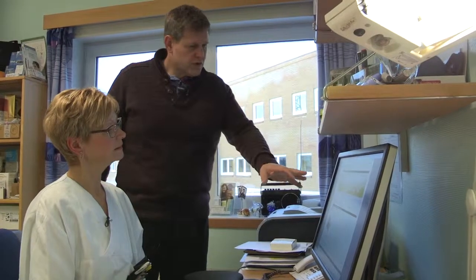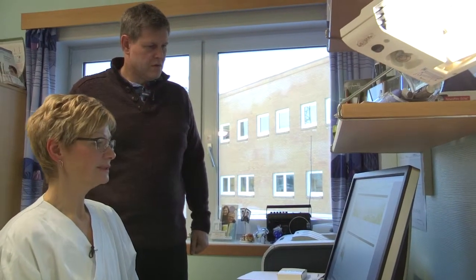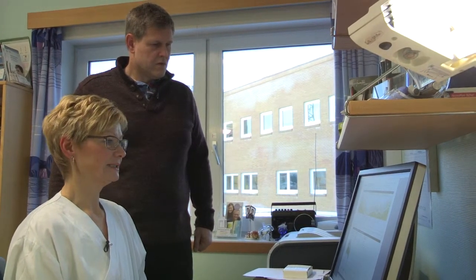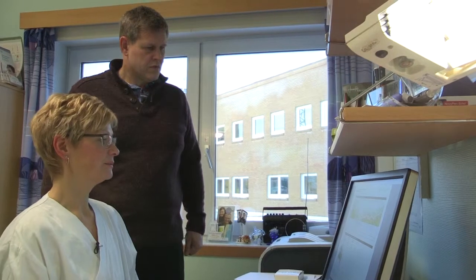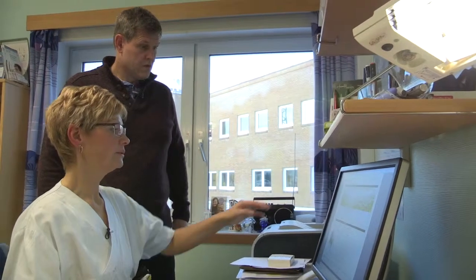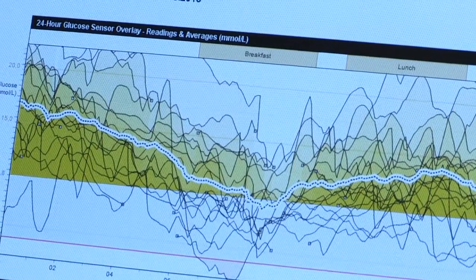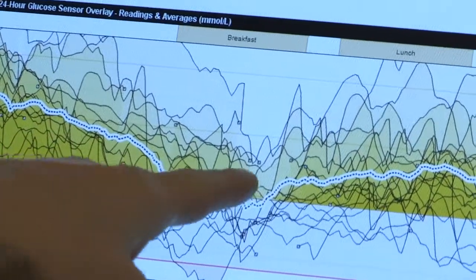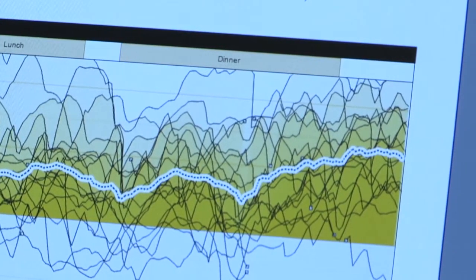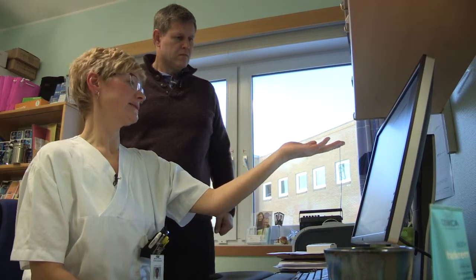Okay, Mona. So what is it that we're looking at here? Yeah. That's all the values of boluses and basal rates from the pump that this person has, because she wears a glucose sensor, so we can see how the glucose has been throughout many days. You see this line that shows the average of this blood sugar in the last 2 weeks, and we see that, okay, here's all the way high blood sugar, so I can say to that person, you have to increase the doses at the basal rate.